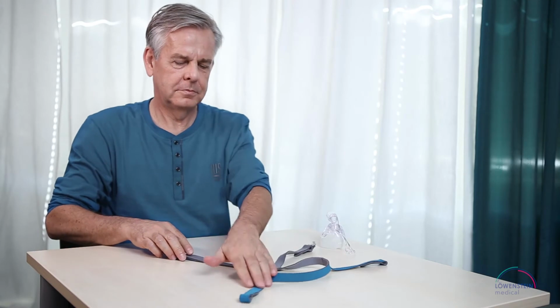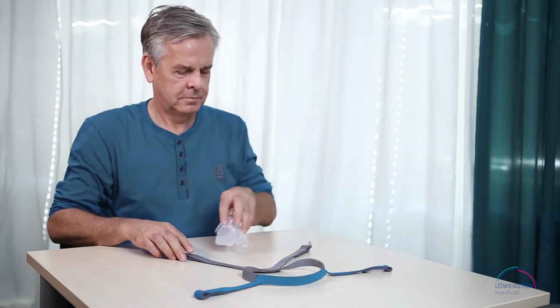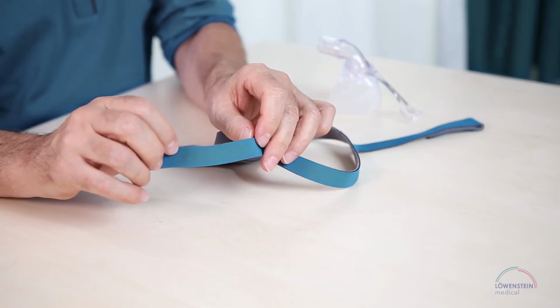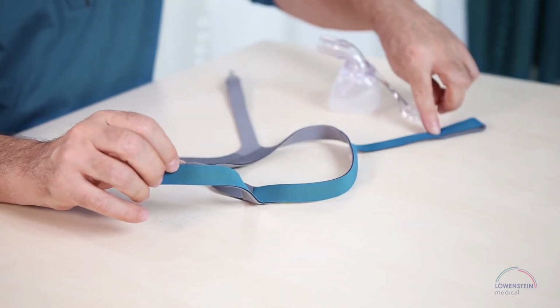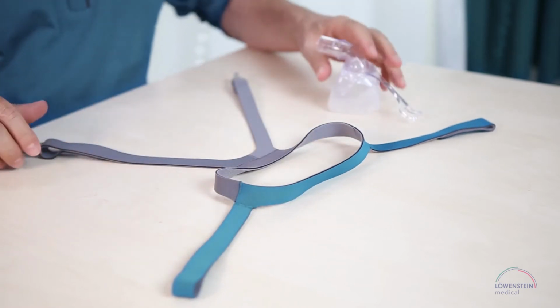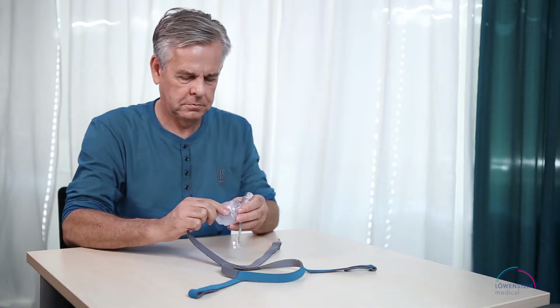An ideal fit of the headgear is very important for treatment. To make it easy for you to assemble the headgear correctly, the upper inner area is teal-colored. The company name is in the middle on the outside, and the clips are underneath.